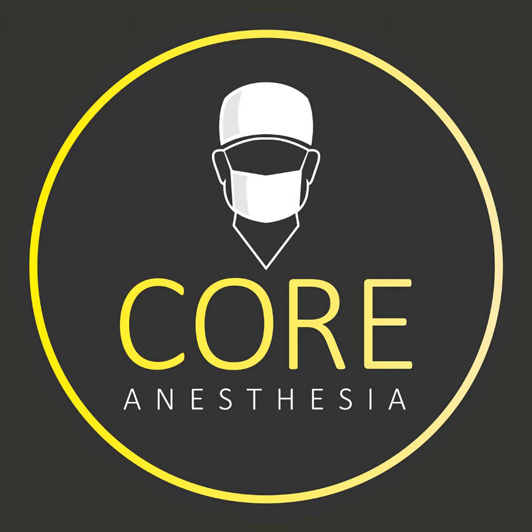So what we mean by that is every inch in elevation you go, your MAP is going to change roughly 2 millimeters of mercury. So let's say I'm taking my blood pressure on my arm and it's right at the level of my heart and I get a MAP of 75. Well, I'm in a beach chair position, so my head is severely higher than where I'm taking this cuff. Let's say it's 10 inches higher. That's going to be 20 points lower on my MAP. So instead of a 75, it's really a 55.